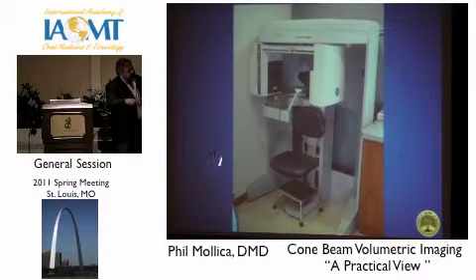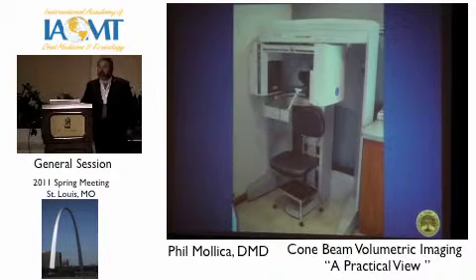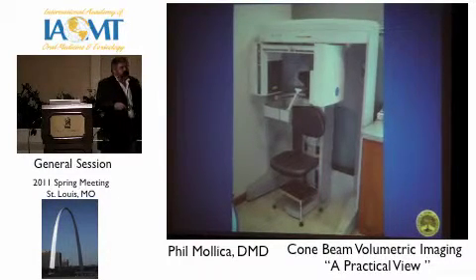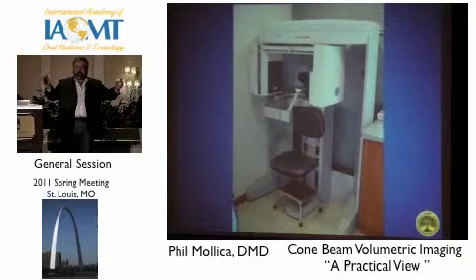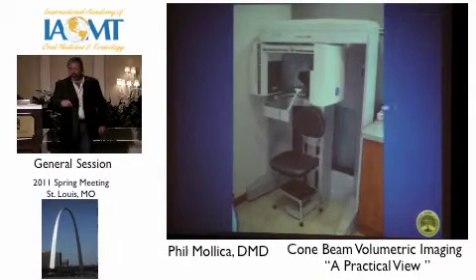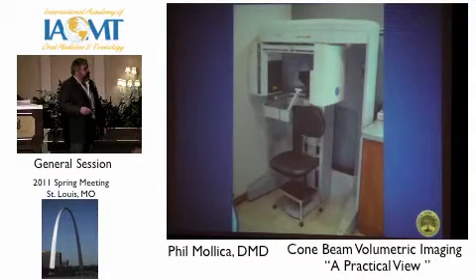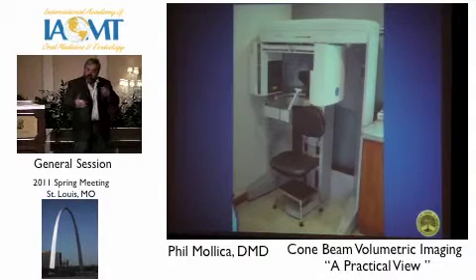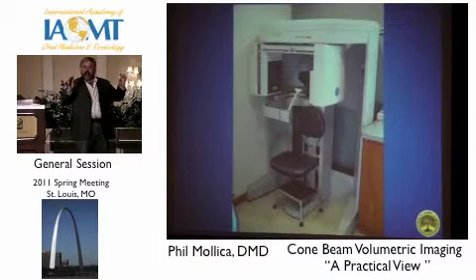Right across here, which I don't have a picture of, and I learned this from my pal Tom Colpitz, who spoke about 3D cone beam about a year ago. We had a little computer screen. He says, Phil, I have like a 60-inch TV to project my stuff. So I couldn't go 60 inches. I went 48 over here. So what happens is I take the picture, and then the patient sits there, the volume renders through, and then we have a beautiful 48-inch screen of all these images.